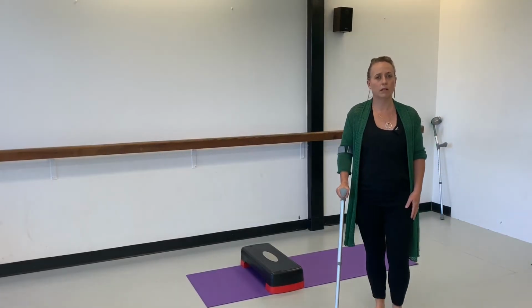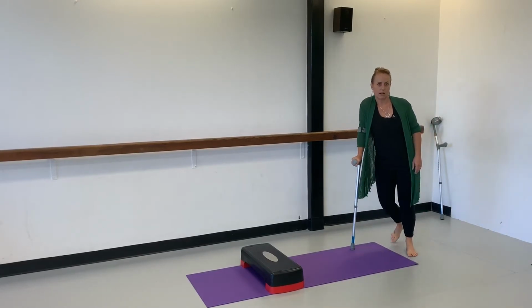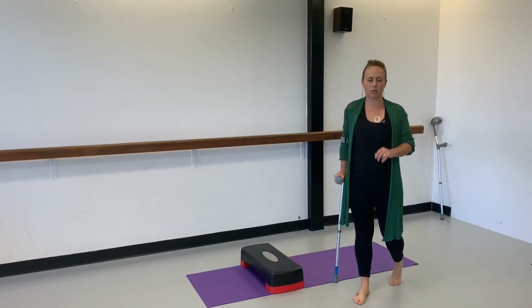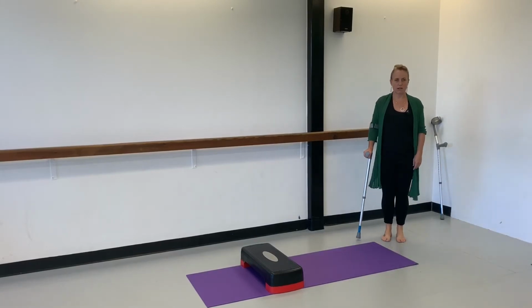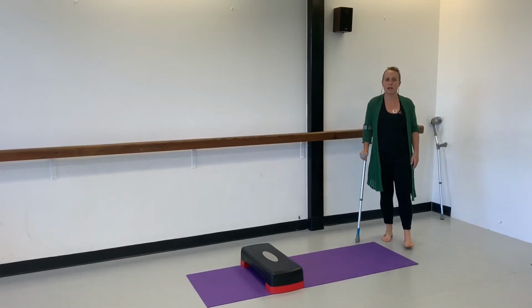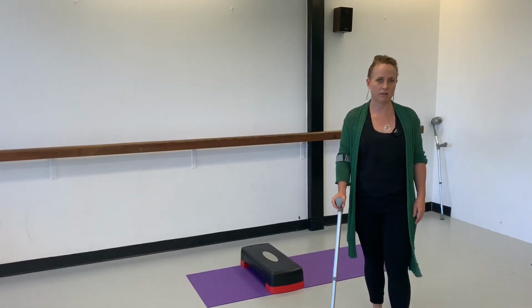Now the common mistake that I see as a physiotherapist using 1 crutch is to start leaning this way. So if you're doing that, you need to stay on 2 crutches for a little bit longer, and that doesn't mean things are going badly. It just means we want to have a normal walking pattern for you. So try to make sure you don't lean on 1 crutch this way because you'll get shoulder and neck pain and it's a very uneven walking pattern. So just nice, even gait pattern, nice and tall. Your crutch is there more for balance than anything else.